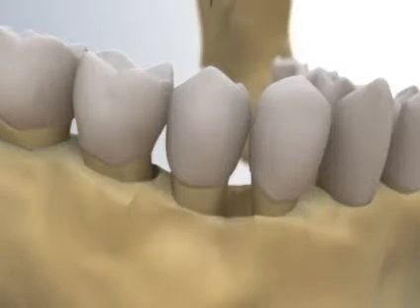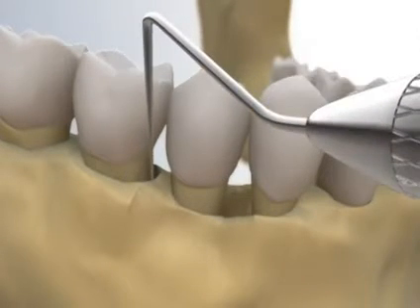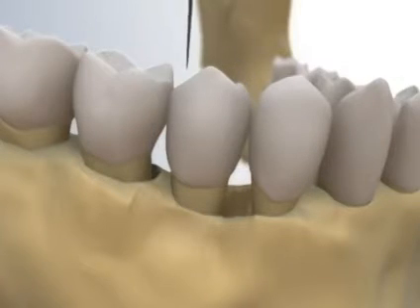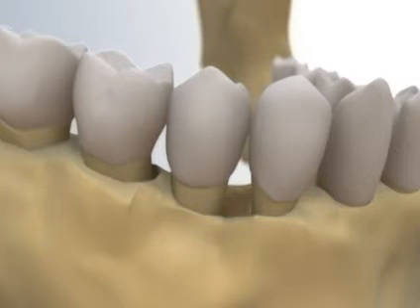Around tooth 4-6, a shallow circumferential defect is present. There is bone loss around the buccal, interproximal, and lingual aspect of tooth 4-6. If these defects are not eliminated, there is a high probability for recurrence of periodontal pockets.